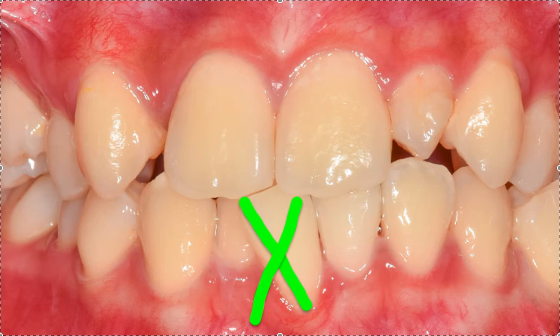And then you could extract the tooth and deliver an immediate Pontic aligner over it the same day, but we're not moving. I don't like to move teeth the same day that I take out a tooth. I think there's too much inflammation already, and the inflammation's going to affect the movement. Let's just let everything settle down and heal up, at least somewhat, for a week or 2, and then we can start moving teeth.